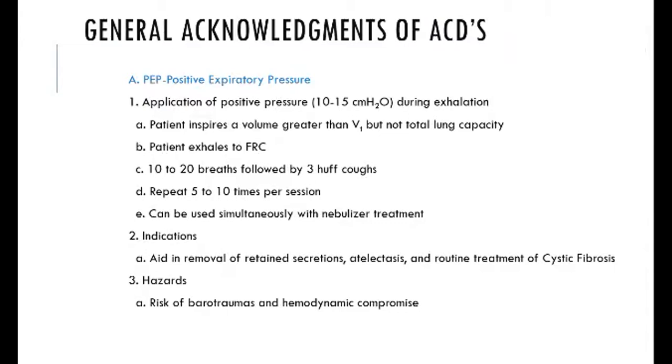Hazards: risk of barotrauma and hemodynamic compromise. Guys, barotrauma is when you stretch the lungs too much, when you damage the lung. Doing it too hard, kind of pulling a muscle in the lung, that's barotrauma. And hemodynamics is the pressure of the blood through the body. The pressure of the blood in the heart, the blood pressure, all that kind of stuff is hemodynamics.